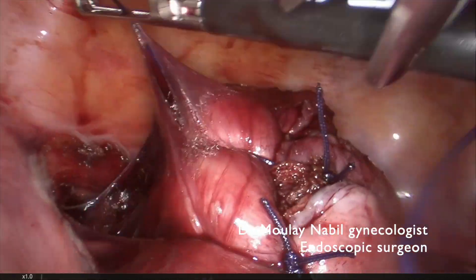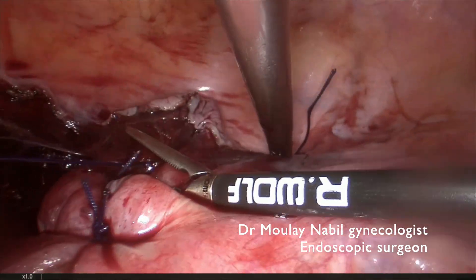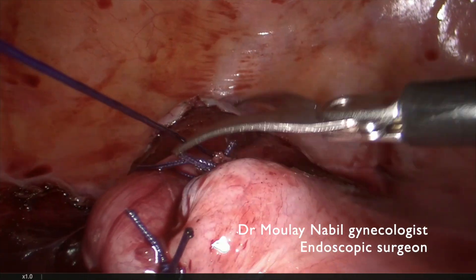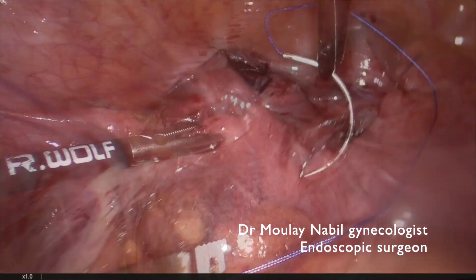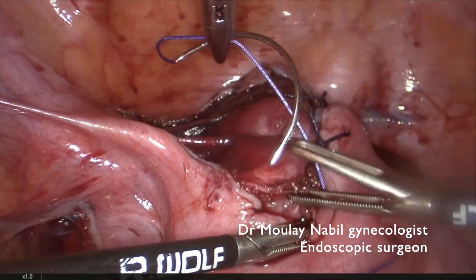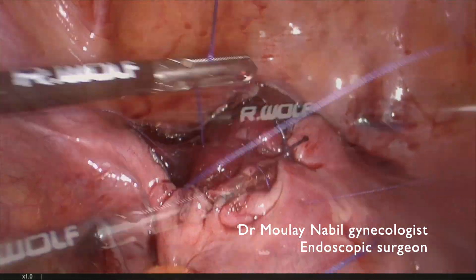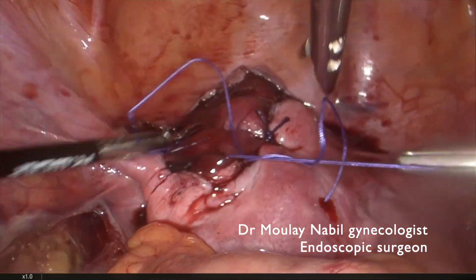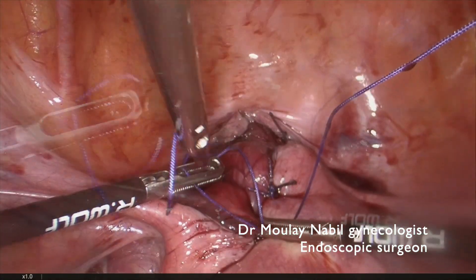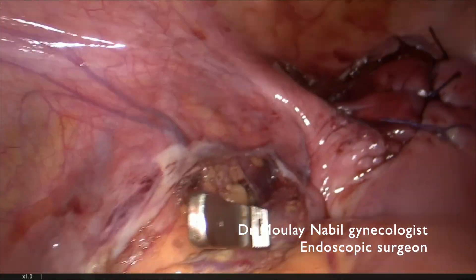I recommend using Vicryl 1, which is a strong stitch allowing a secure knot. The procedure is quite bloodless — this is the last stitch. There is no risk for the tube because we are just under the round ligament. Now the myoma bed is completely closed with no area of bleeding.